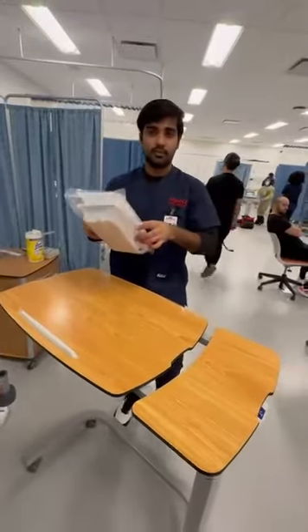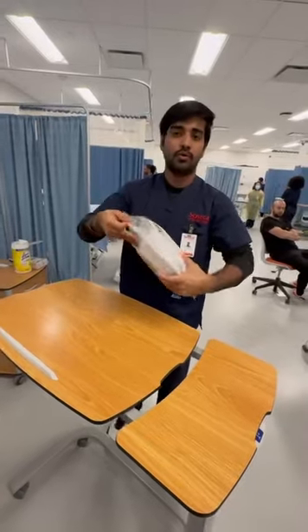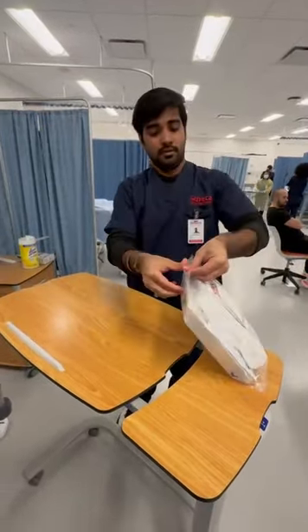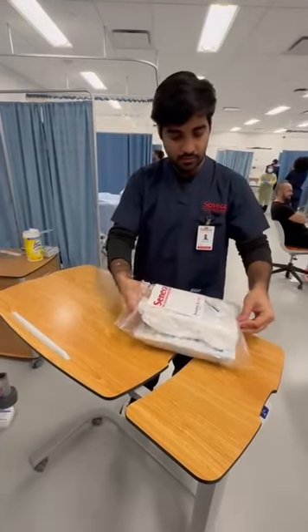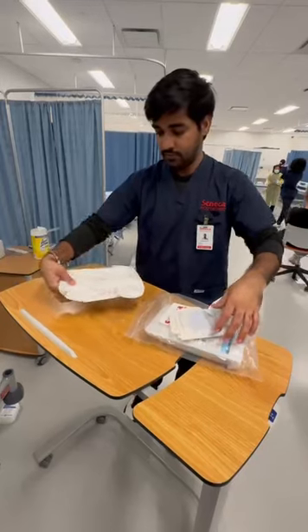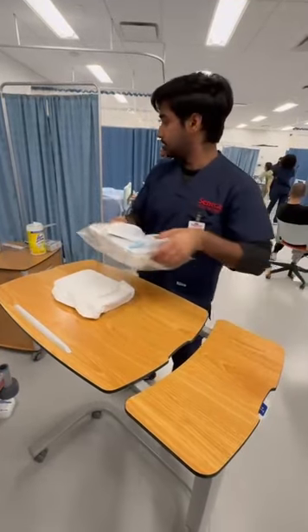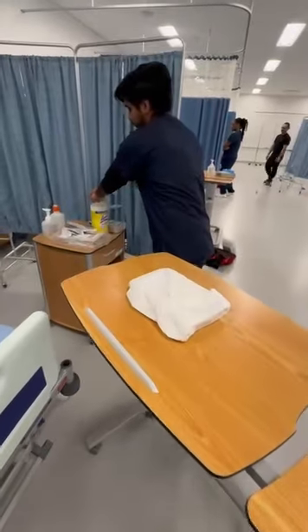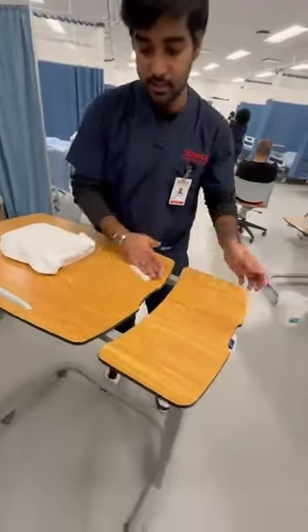I will use this to set up my sterile field. Do the right upper. So you put in the solution. I'm going to make sure it's properly drained, like I'm going to press it against properly. Just making sure I have cleaned it again.